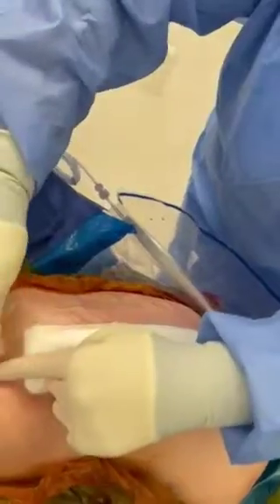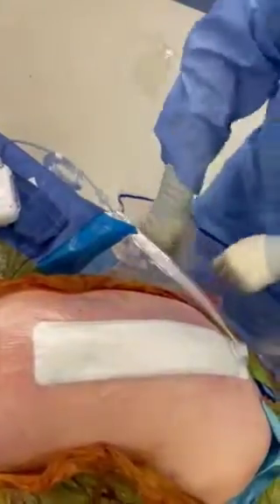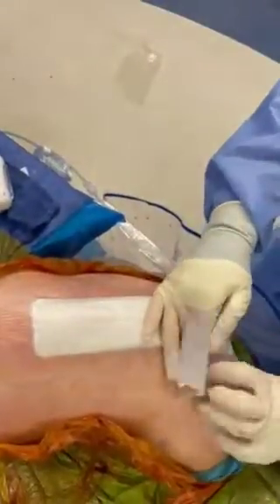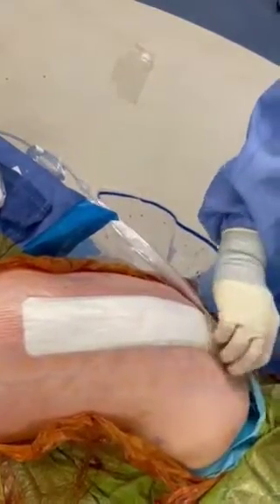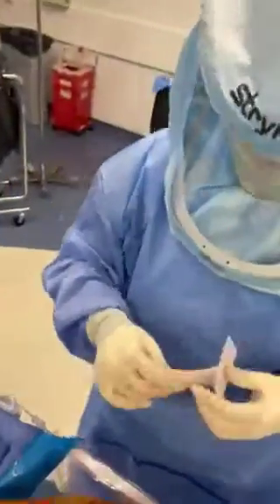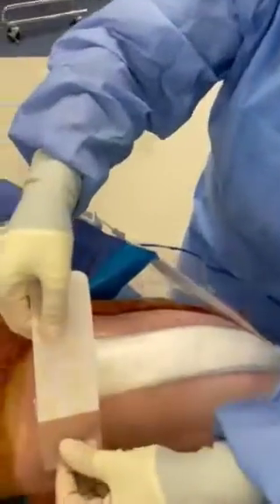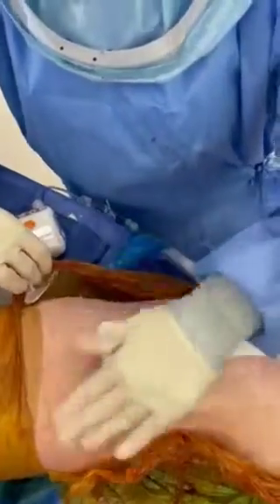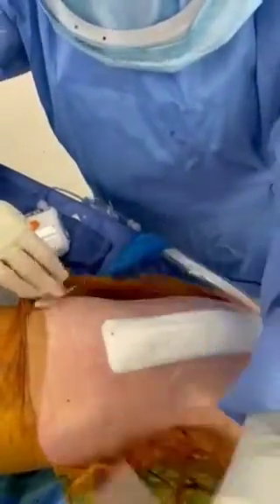Just a little peel and pull. Beautiful. And we'll do that on each side. Nice, smooth. Peels off, and then that's when I'll use my little end pieces for these shorter ends here. So same thing, smooth and pull.